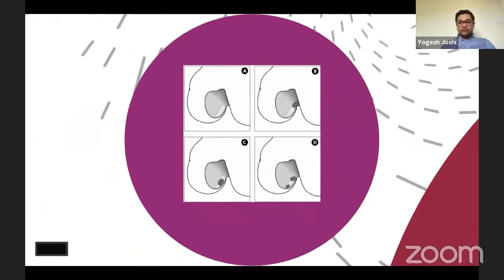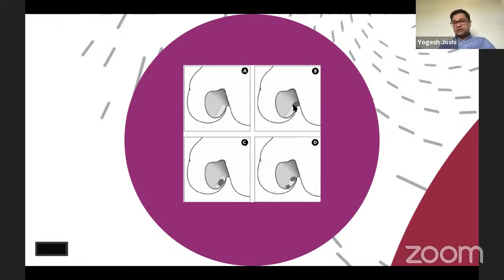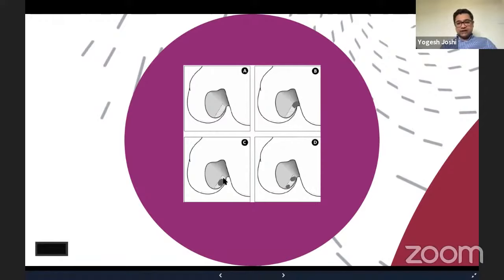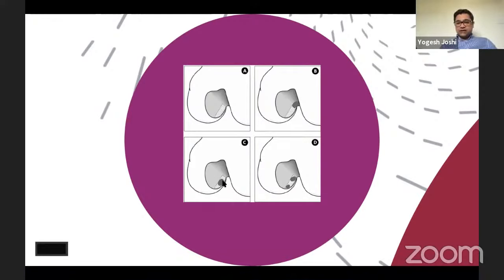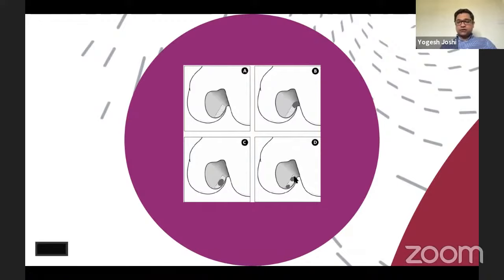From the medial viewing portal you can see the footprint of the ACL. When doing a trans-tibial tunnel, the position ends up quite superior — that was the mistake, and the reason patients didn't achieve full outcomes from ACL reconstruction, with associated failure rates. Nowadays we go to a single bundle tunnel into the center of the footprint. Because we are visualizing from the medial side and drilling on the lateral femoral condyle through the medial portal, we need two portals on the medial side. The same applies for the double bundle technique, which requires two tunnels on the femoral footprint.